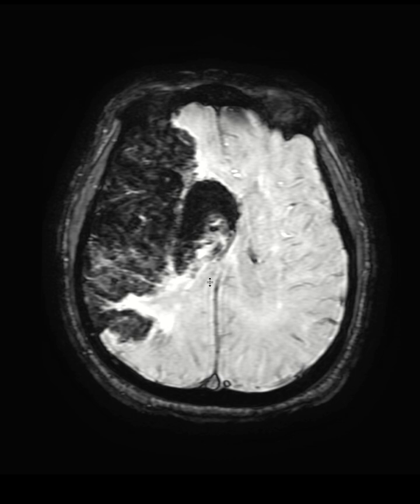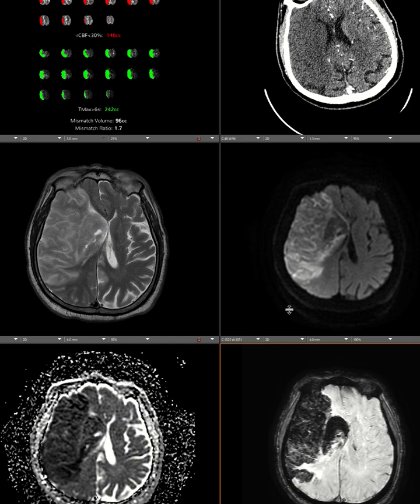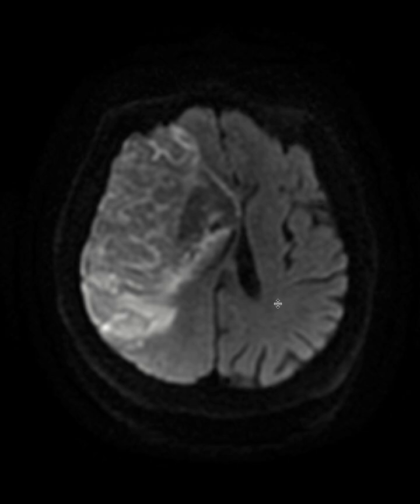So the point of all this is, in stroke cases, we know that these patients clinically have some signs of a stroke. So our job is to say, is there any tissue that we can salvage? Is there any large vessel occlusion that is actionable by doing thrombectomy? And then in subsequent MRIs, our role is not just saying there's a stroke. People know the patient has clinical symptoms. We have to say how much infarcted tissue we have, do we have any mass effect, and do we have any hemorrhagic conversion. So make sure you put the relevant and important information for clinicians in your report.